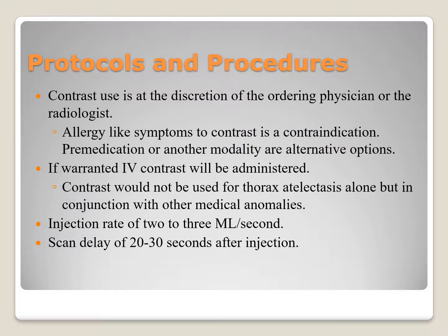Contrast is often used for a CT of the thorax, but like 3D rendering, it is not used for atelectasis alone. The use of contrast will be up to the ordering physician or the protocol set by the radiologist. Finding out if the patient has had an allergy reaction in the past is crucial and a contraindication. Pre-medication or another modality are alternative options.